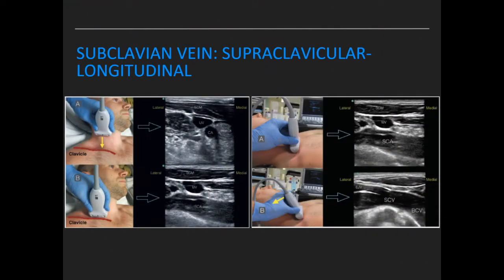On the longitudinal view of the subclavian vein, the needle should only be advanced once all structures including the pleura are visualized on a single image. The probe is slid towards the clavicle to visualize the IJV and the subclavian artery, and then tilted to visualize the subclavian vein before cannulation.